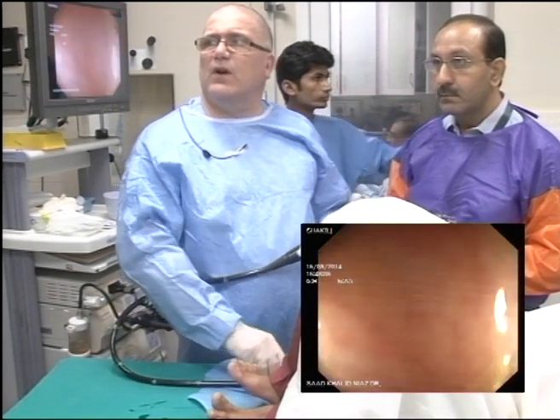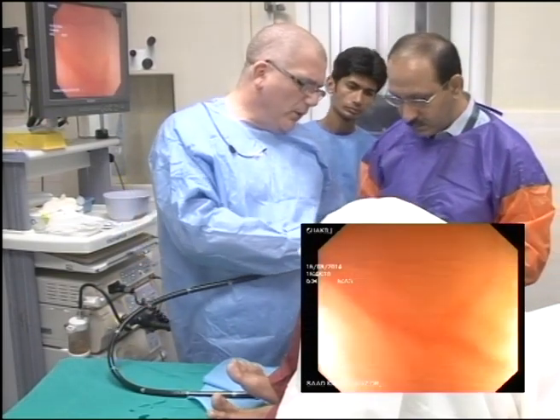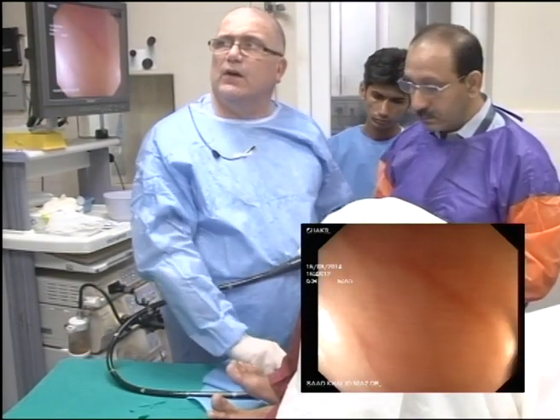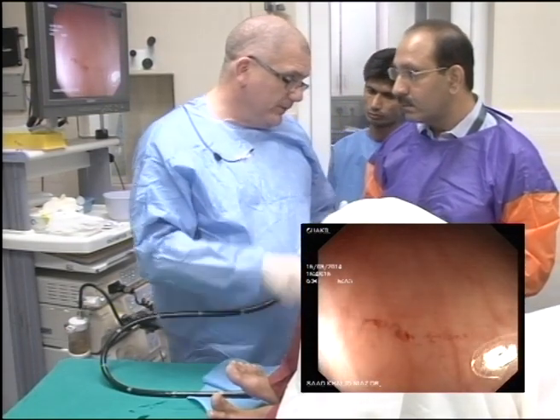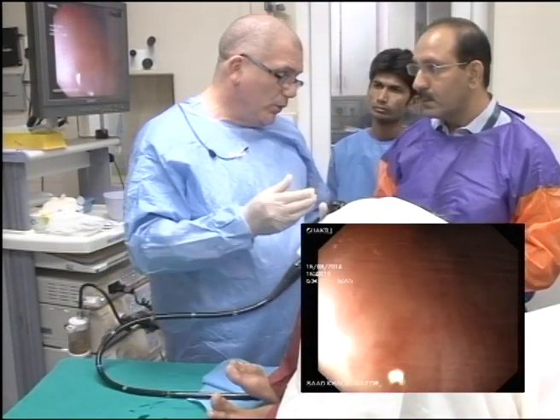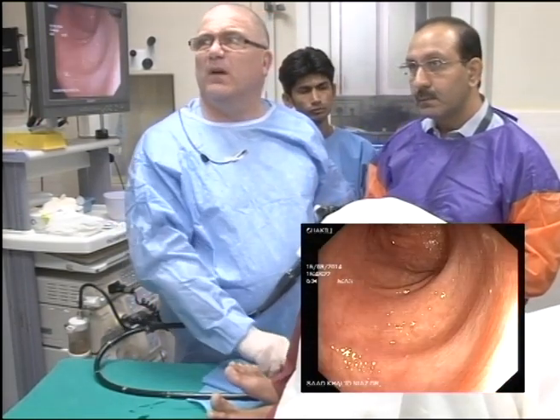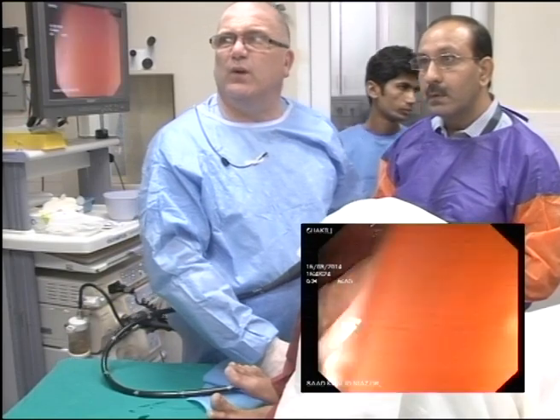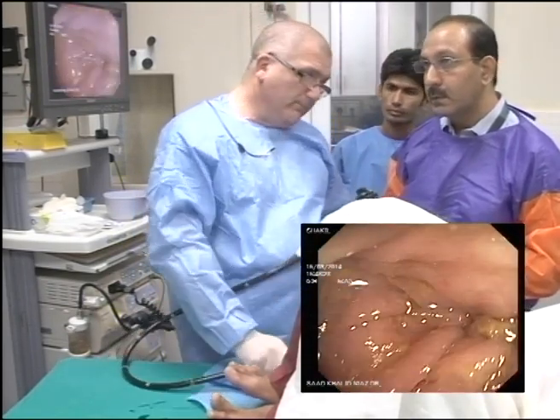Now this man's got a lot of spasm. So when you've got a lot of spasm, you've got a few options. Your options are, do we put some warm water in? Have you heard about using warm water? Warm water down the scope? Warm water? Yeah, warm water down the scope. Or you can use Buscopan. I don't like Buscopan. Glucagon.